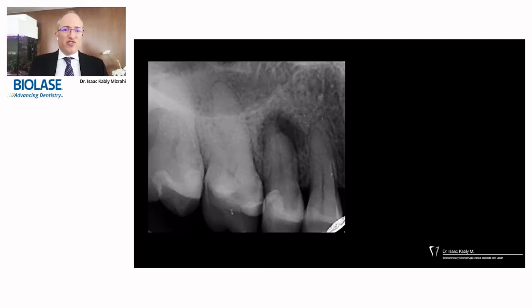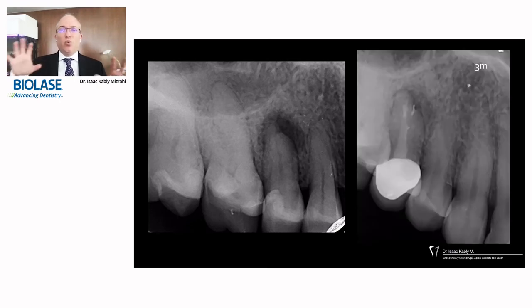As endodontists, as general dentists, we know we have these complex anatomies, and we know we're not always able to reach the end of the radiographic apex of the root. With lasers, even though we're not close to that point, we can achieve some regeneration because, as I said in the beginning, it's the disinfection that works with the transmission and scattering of some of the energy to the surrounding tissue of the apical foramen that gives us all that disinfection and promotes some healing at the same time.